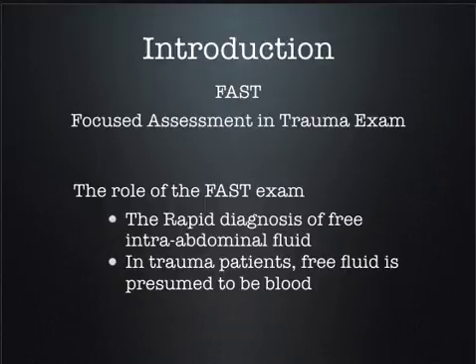So it gives you a method of looking at the abdomen, whether you're an emergency medicine guy, like a lot of us, or whether you're a surgeon and you're going to be doing trauma, or whether you're internal medicine and you're just looking for ascites or looking at the liver. It gives you a way of looking at the liver in a systematic approach.